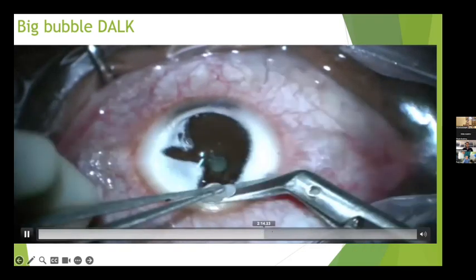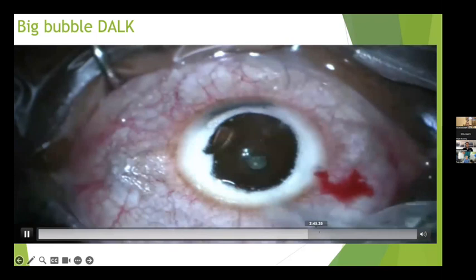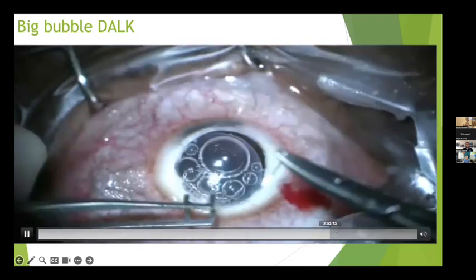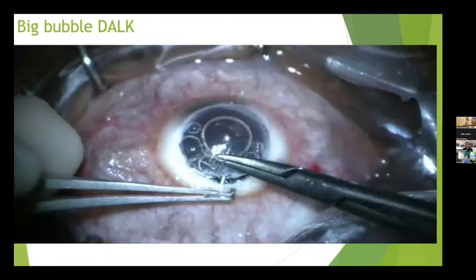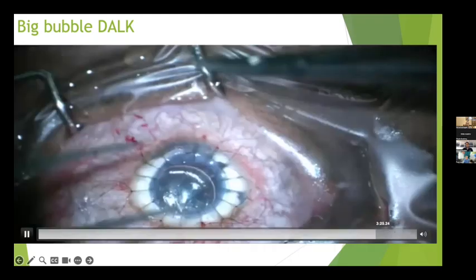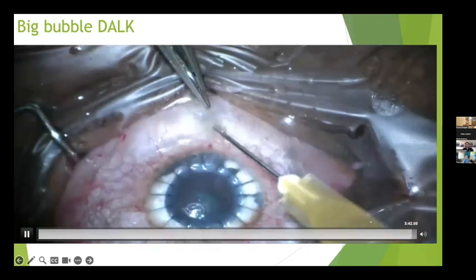So I'm gonna skip that. It's similar. I explained to you my preference of the scissors and why this is my preference. There is a bit of ledge around the edges here, so I'm just gonna trim that before going towards the graft. Of course, we've removed Descemet's membrane from the donor graft, and now just 16 interrupted sutures. And finally, just adjusting the pressure in the AC, filling it with aqueous, with BSS, and then subconj.